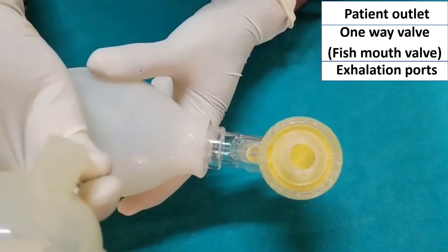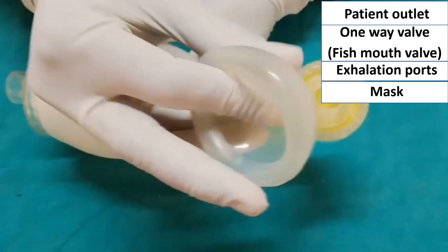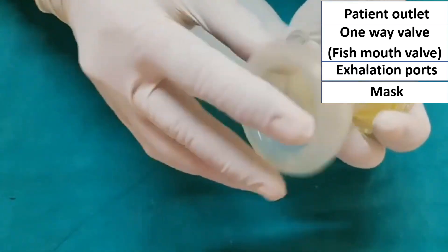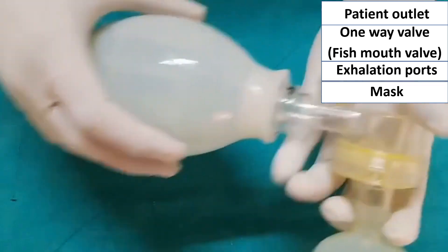Now I am attaching the mask. We should keep the finger over the hole when we are attaching, and then press. So the mask is tightly attached.